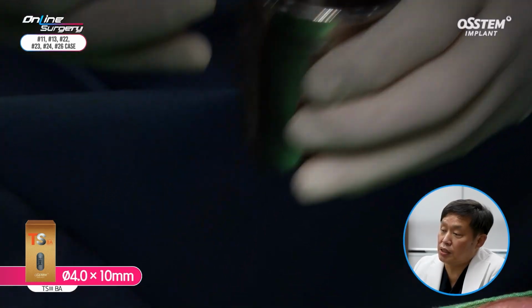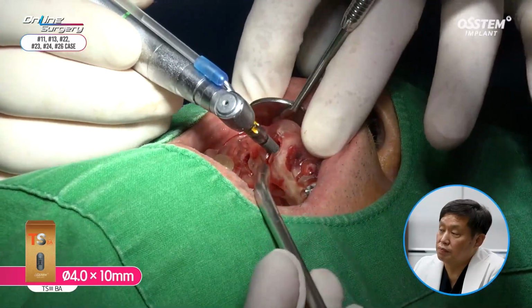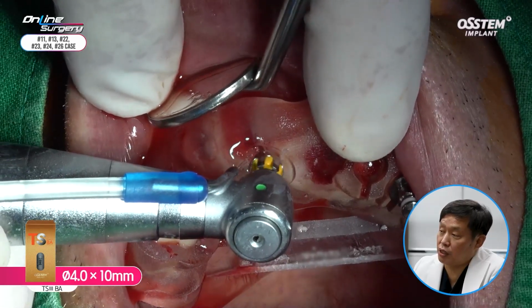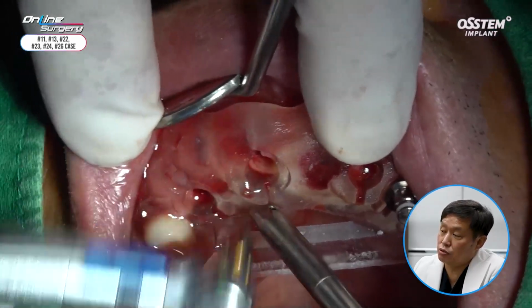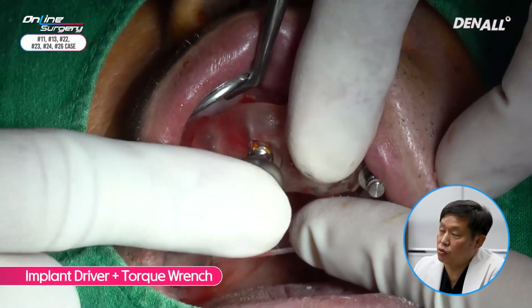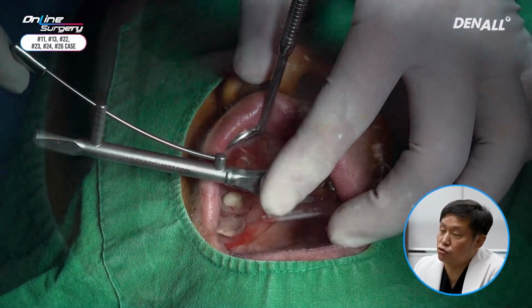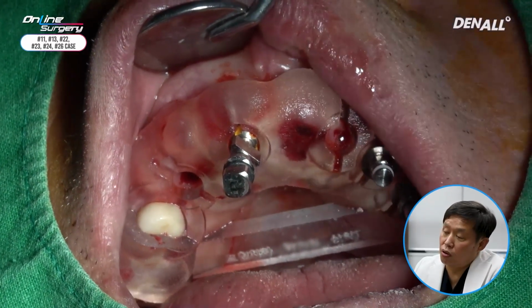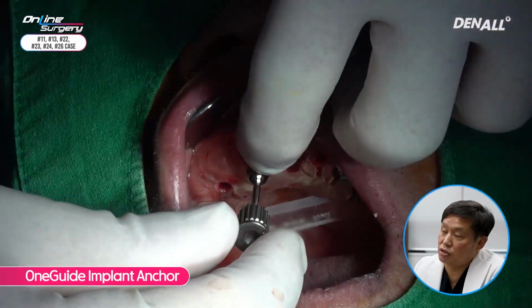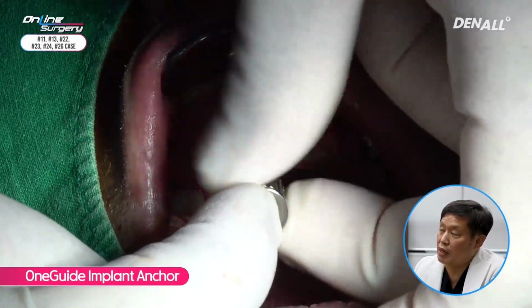In number 11, 4.0 by 10 mm TS3 implant was placed. Because there were 2 vertical anchors on the left and a tooth on the right, the template was fixated for sure, and implant driver and torque wrench was used to adjust the final depths and position hex. Primary stability was sufficient. In number 11, OneGuide implant anchor was connected. In this clip, I wanted to emphasize the use of vertical anchors, so I used it as much as possible.